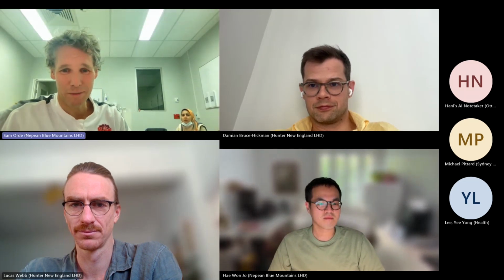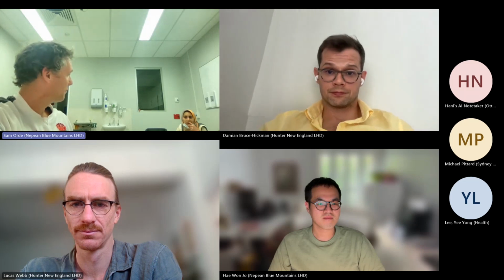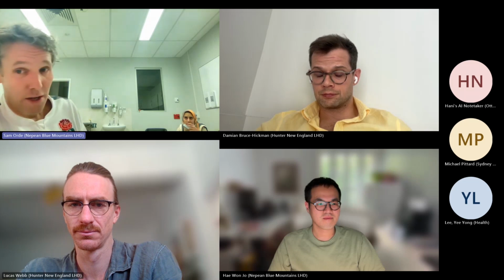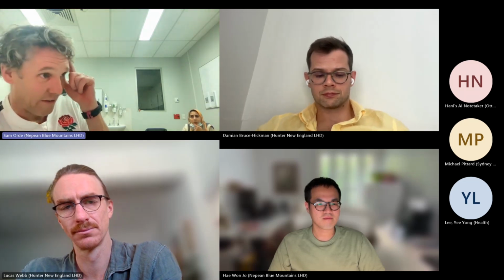Do you have any questions you'd like to ask? Thanks, Sam. Oh yeah, hang on. We got a question from Umi. Yep. Do you only get it in severely raised? No, do you hear that? So that was a question about the L wave. I don't know who asked, but they said, do you only get that in severely elevated pressure?